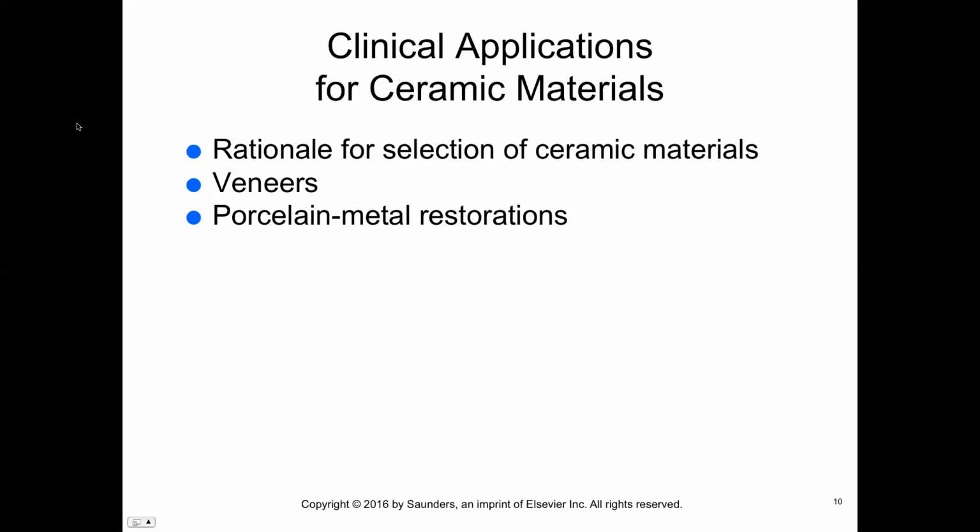The most commonly used restorations in fixed crowns and bridges are combinations of porcelain and metal. Low fusing porcelain is used to bond to the metal. When porcelain is applied to the metal and the two materials are heated together, the porcelain chemically fuses to those oxides on the metal, forming a durable bond. These restorations are strong enough to be used in the posterior.